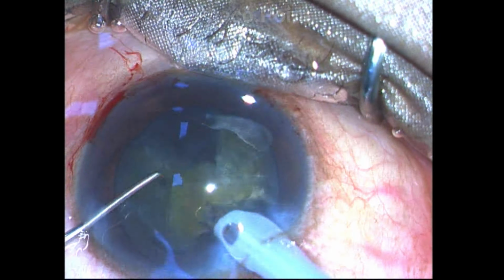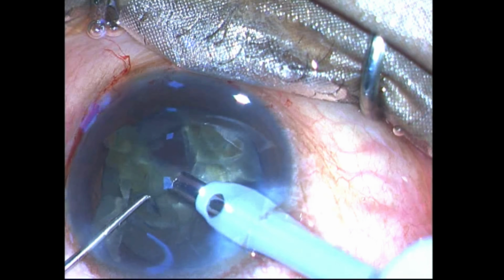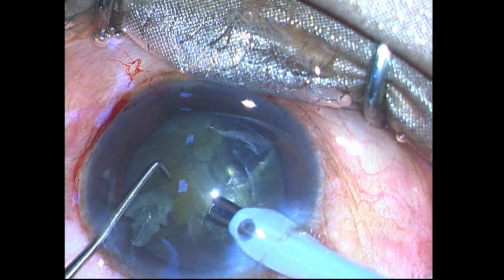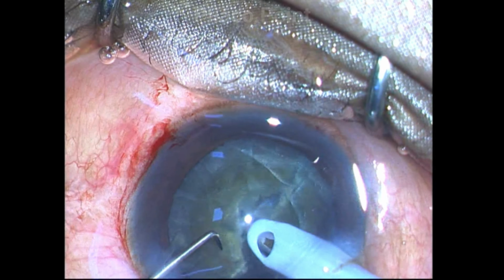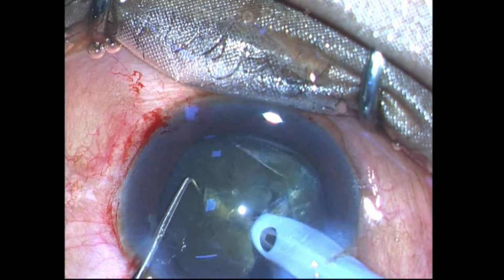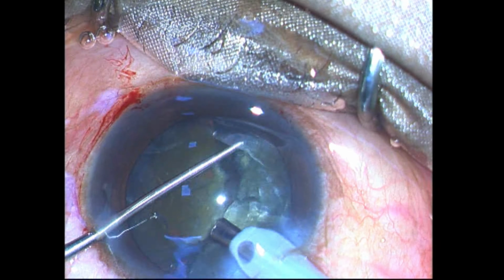Since this fragment has just come up, it is subsequently emulsified. The surgeon then proceeds after emulsification of the fragment to further subdivide the other half of the heminucleus. So it's rotated into the optimal position. The surgeon is still in position 1, then buries in foot pedal 3, creates the mechanical chop while holding it in foot pedal 2, and then again finally in foot pedal 1.